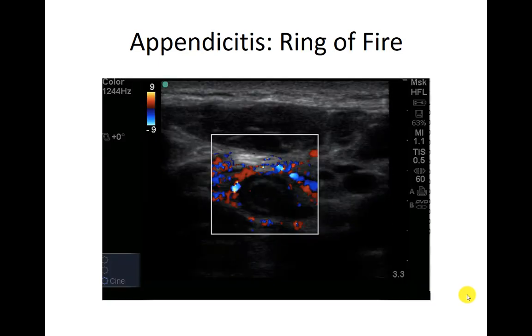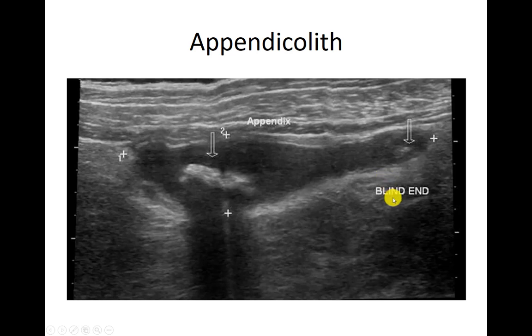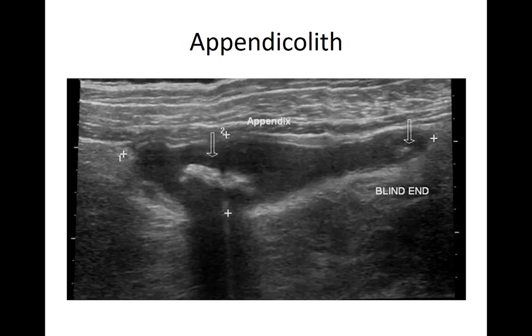Another sign is hyperemia — sometimes called the ring of fire. Hyperemia would imply that there's some inflammation in the area. Here is the actual appendix and all the vascularity surrounding it. Here's an example of an appendicolith — just like gallstones, these are hyperechoic structures with shadowing behind them. We have this blind-ended pouch and then this white thing with shadowing. One key with appendicitis is looking all the way to the tip, since appendicoliths often live at the very tip. There's also tip appendicitis, where just the end of the appendix is inflamed.